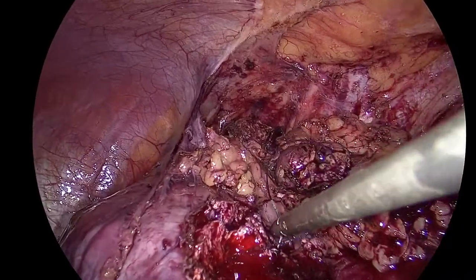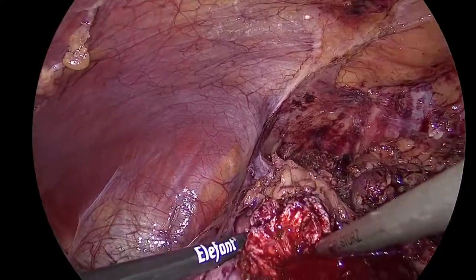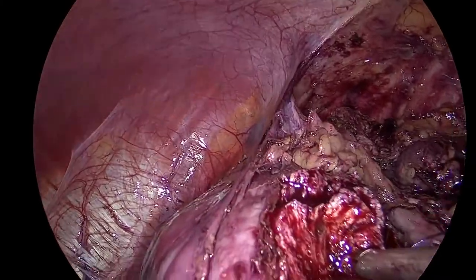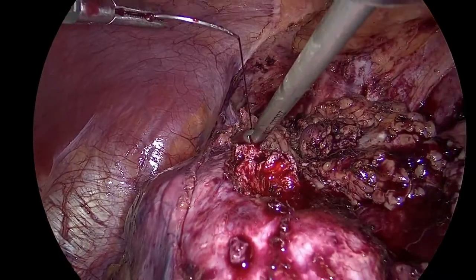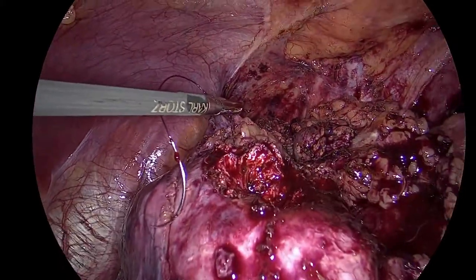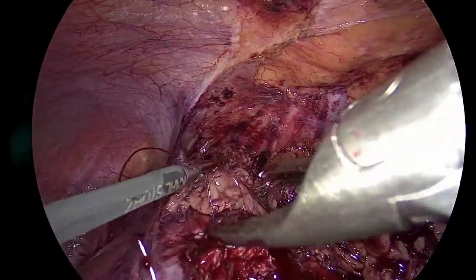It's outside, but it's fine. Give me the grasper. It's on top, outside. Prepare a clip. Give me the clip. This was not intended to go like this, but at the end it went nice. I think the suture sometimes... Good. Harmonic.